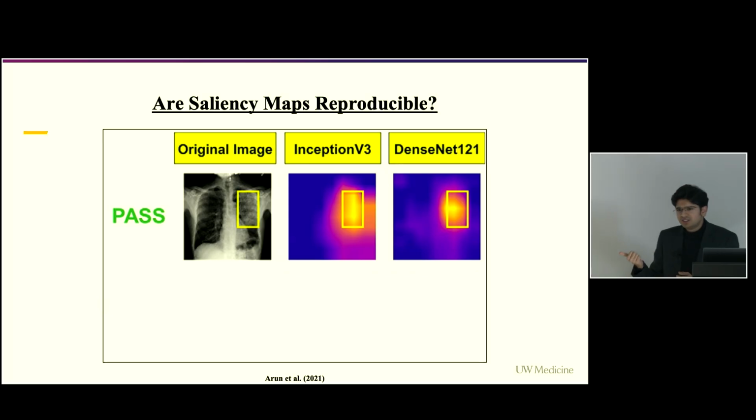So how do we feel about this example? Does this mean that the two models giving comparable performance are looking at the exact same clinically meaningful attributes? Thus implying that both of these companies did an amazing job creating a model, and then maybe a clinician just has to see which one is cheaper and integrate that.